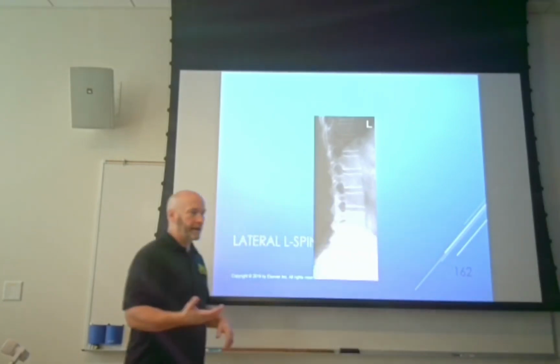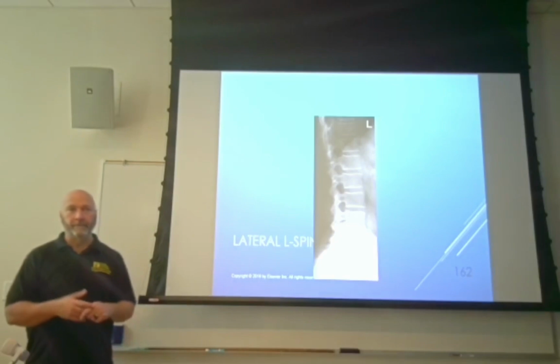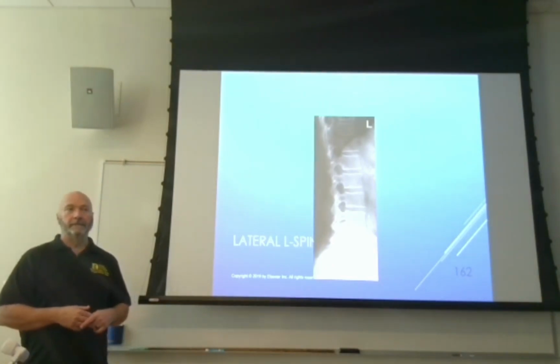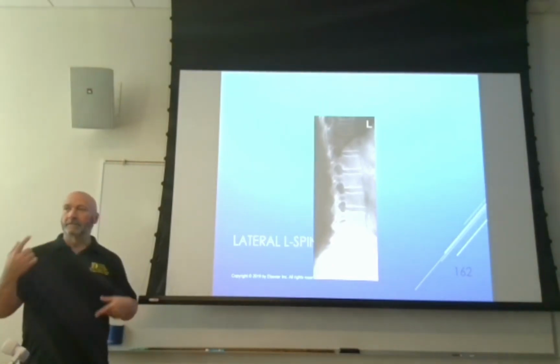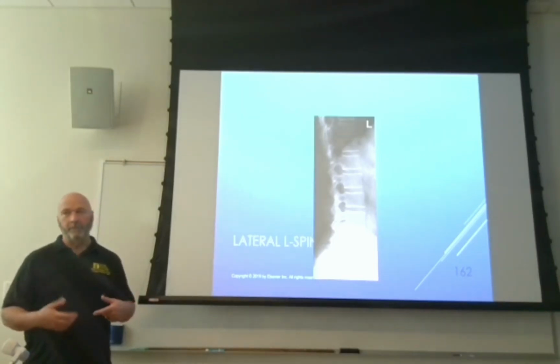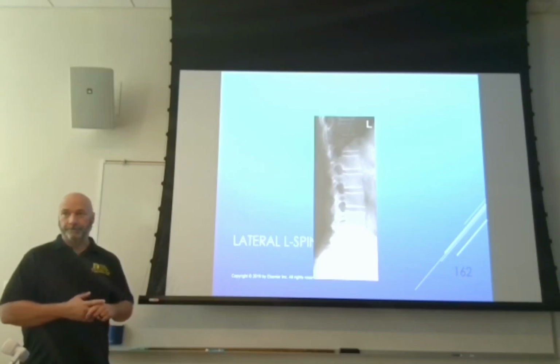We're getting ready to do an IVP on the patient. I don't know if you know what an IVP is, but we inject the patient with 100 cc's of contrast directly into the veins. So that circulates inside the patient's body, increasing the blood volume, probably the blood pressure in the patient.